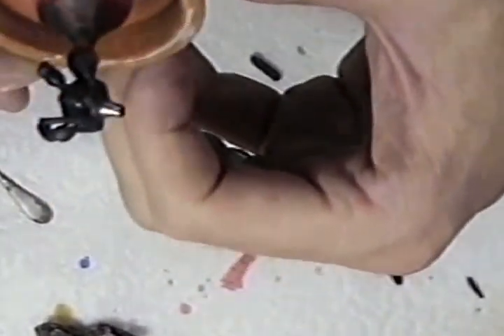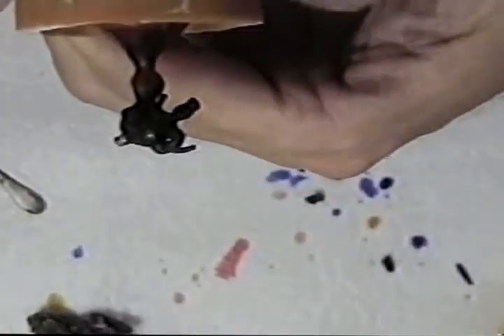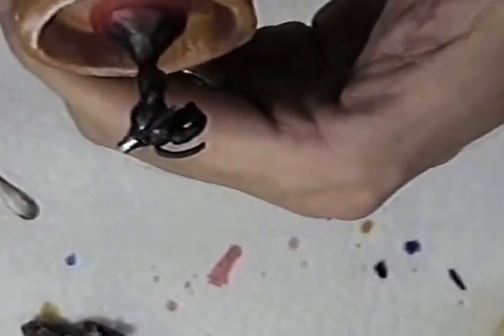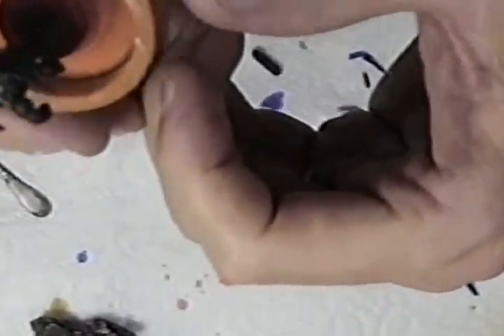I'm really trying to stay away from having any porosity whatsoever, and I don't want to have to reorder an abutment. So that's why we have all the sprues here, all the reservoirs, and I don't think you can put too many on it, really. It is going to take a lot of gold to cast, and it's going to be a real challenge. So I'm going to go ahead and get ready to invest it, and we'll take a look at that in just a minute.